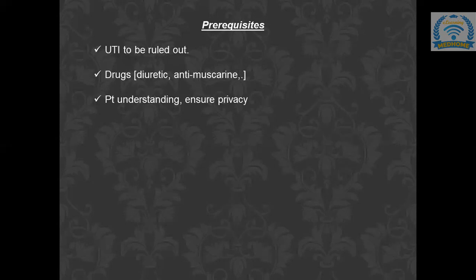We also need to ask in the history of the patient about the drugs, what type of drugs she is using, if she is using any antimuscarinic drugs or any diuretics. We need to stop these drugs because she cannot undergo the urodynamics procedure then.